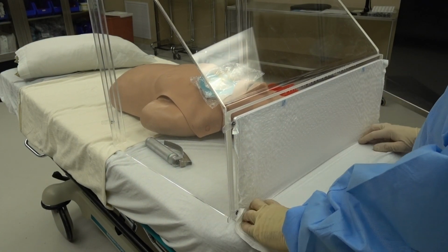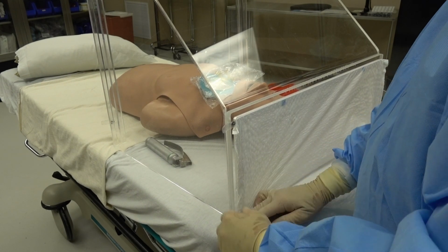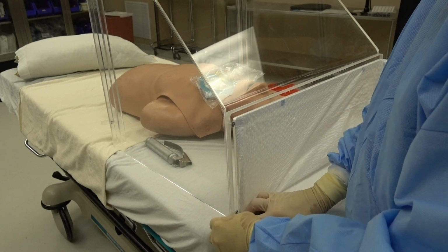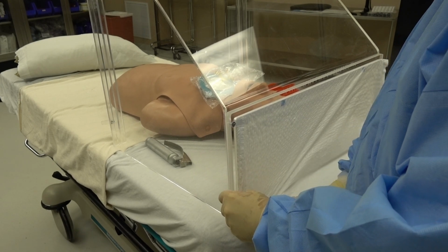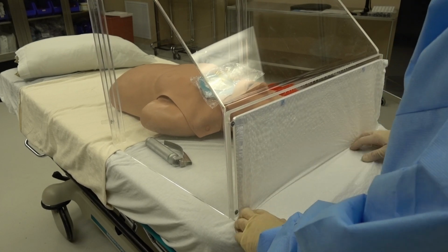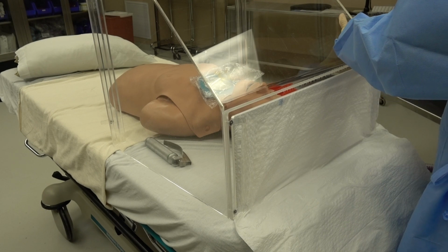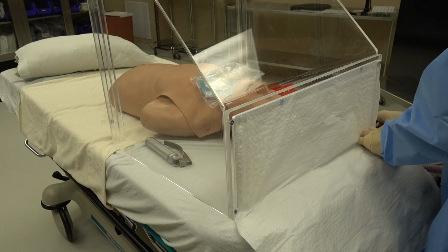Now I like this membrane tight before I pull the pins down. I like to do this one up and this one down, and that gives it as tight as you can get it. Now really what makes it tight is when you place it, you've got to push that in so it's flush. What really makes it tight is when you place it underneath the edge and use the weight of the containment chamber to hold it. So again, place it flush, and just rotate the rings there.